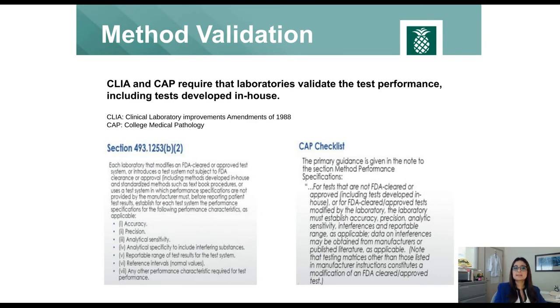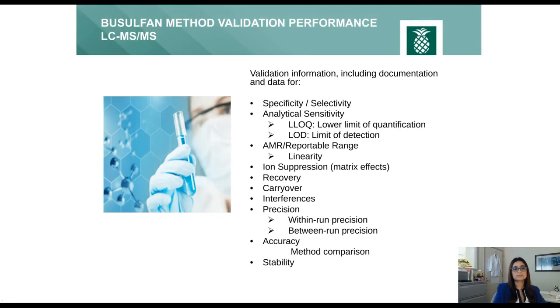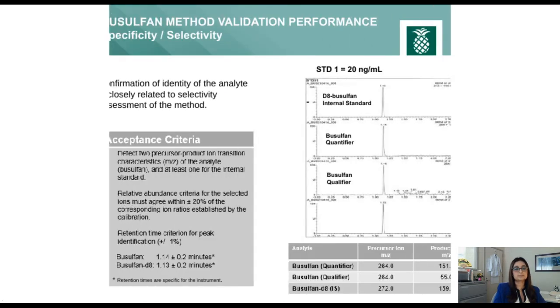Currently, most of the mass spec methods are laboratory developed tests, or LDT, which require extensive technical and analytical expertise prior to clinical implementation. In our lab, validating the busulfan method according to the requirements of CLIA and CAP was part of our work. During this process, the lab must establish the acceptance criteria for each component of the method validation.